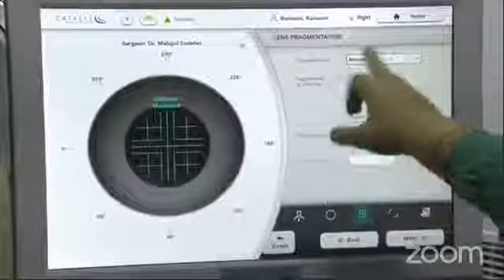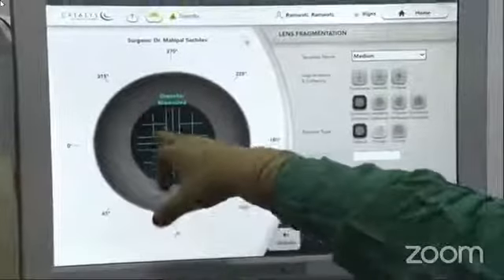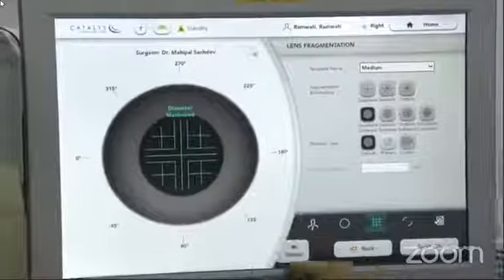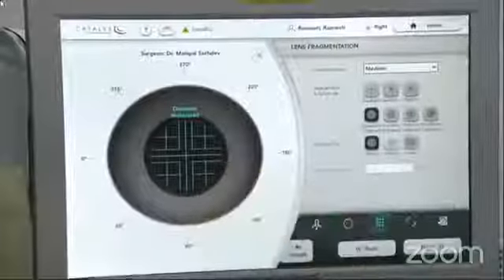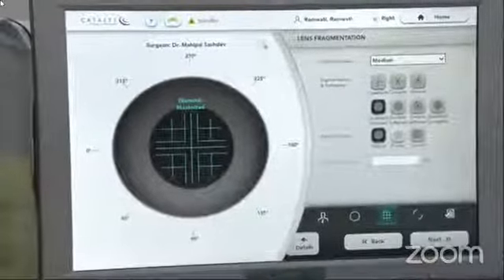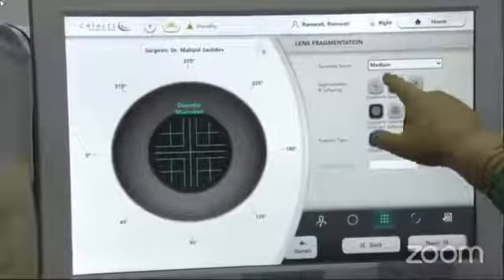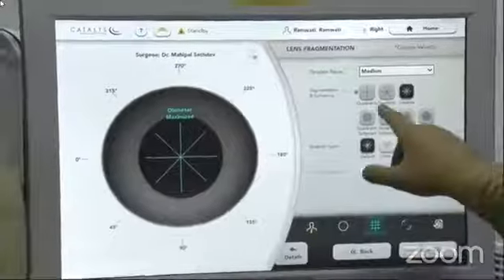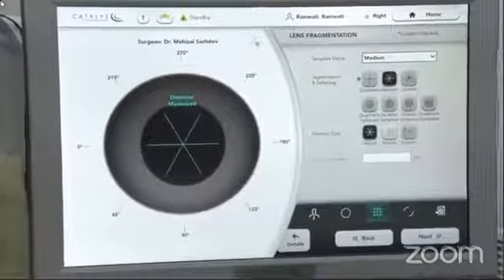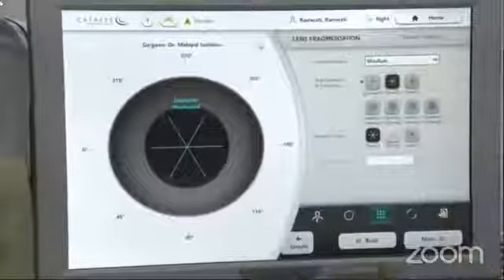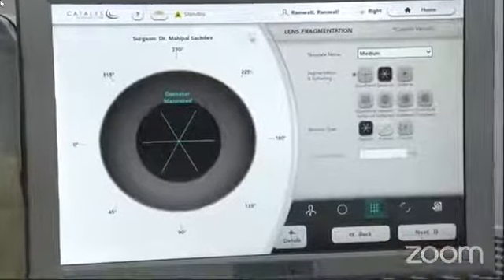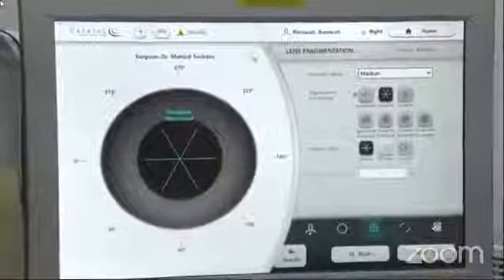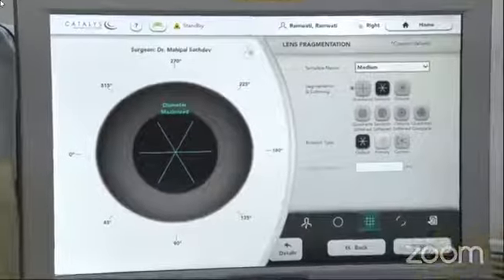After that, we will be trying to break this into four quadrants and then small pieces. These pieces we have kept at 1500 microns and this is 500 microns. In the new software, when you are cutting with higher repetition rates, you can skip the central one millimeter, which will reduce the time taken for the nucleotomy significantly.